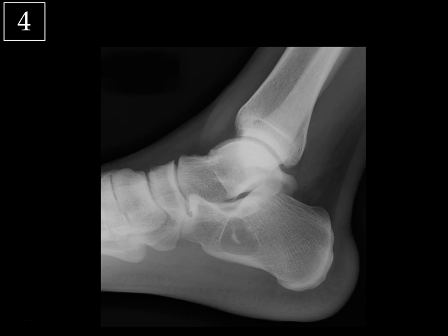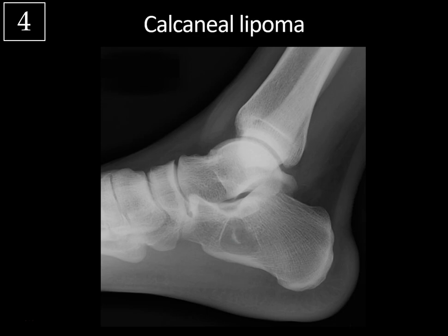This is a lateral x-ray of the ankle. We don't see any fracture, but there's a well-circumscribed lucency in the anterior aspect of the calcaneus, and more closely you can see a central calcification as well. This is typical for a calcaneal lipoma — an intraosseous lipoma that is completely benign. The calcaneus is the most common location for intraosseous lipomas. That central calcification is known as the cockade sign; you might also see ossification or fat necrosis on CT. Without the central calcification, the differential in the calcaneus would include unicameral bone cyst.